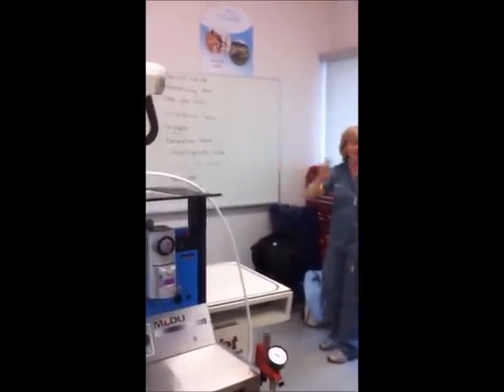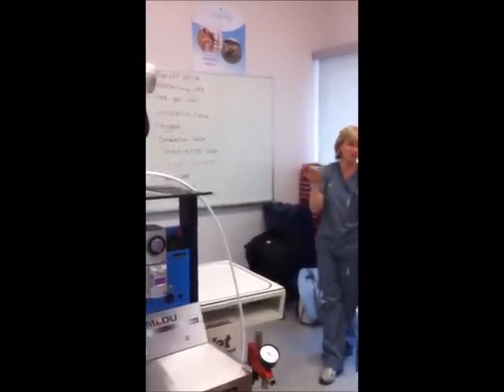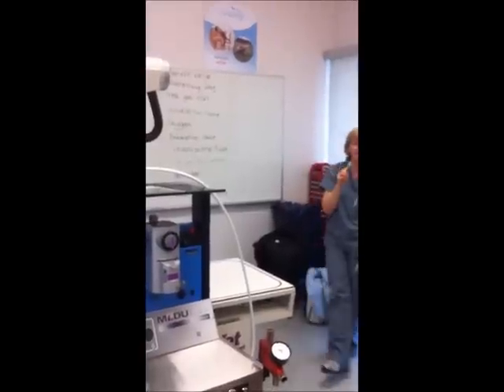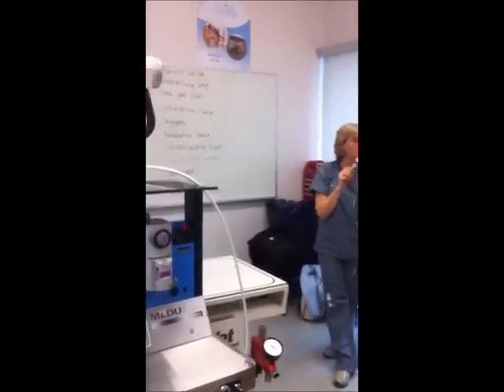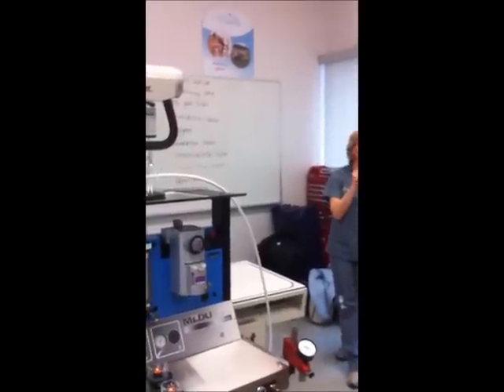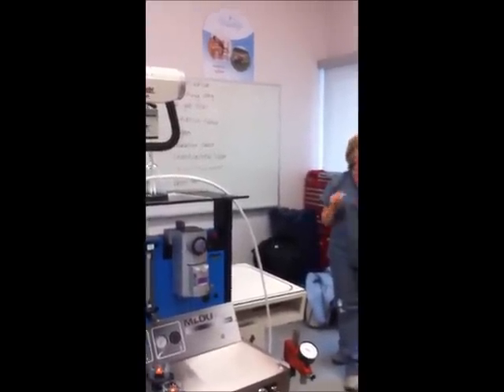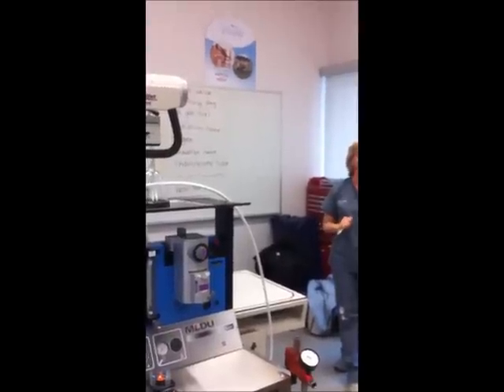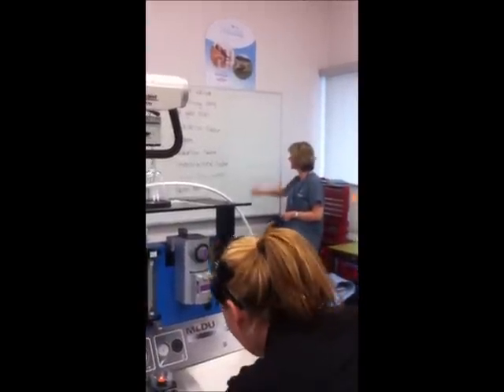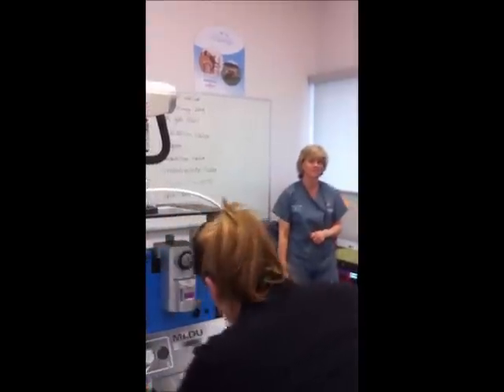But I have taught you enough to figure this out. And I'm going to ask one question off the get-go that should help you. If you had to try to figure out where the rebreathing system was, even on a schematic like that, what did I teach you? Identifies rebreathing over non-rebreathing. What's one thing that one has that the other doesn't have? Soda lime. Soda lime. So if you see something like this that's got a square in it like that, bam, you know. Okay?